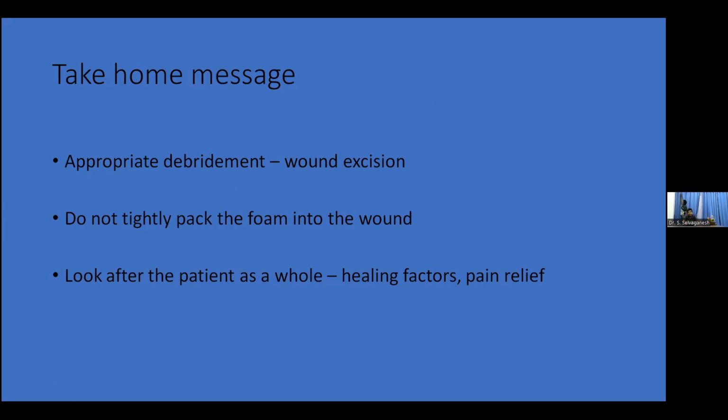Appropriate debridement of the wound is very important. You will learn during this lecture the application of foam to distribute the pressure evenly to the wound surface. You should not pack too tight, and don't forget the patient as a whole. You are thinking about healing factors, pain relief, and other therapy modalities, so you don't concentrate only on the dressing.